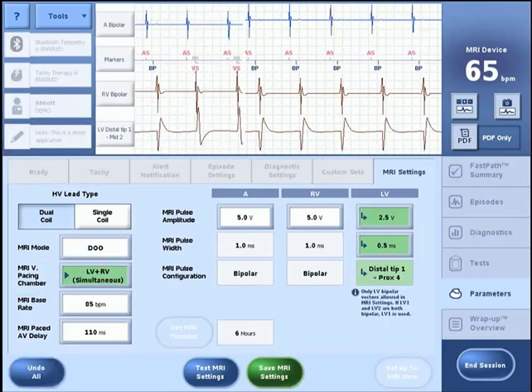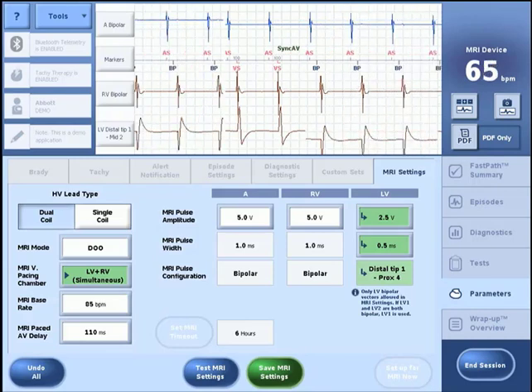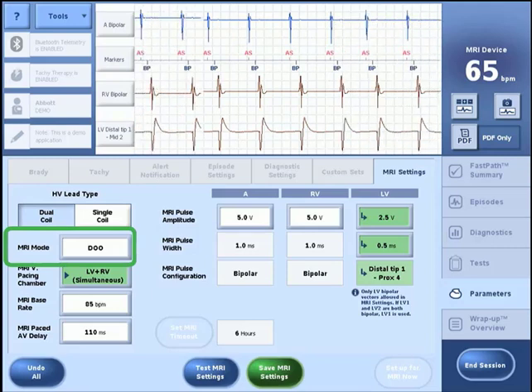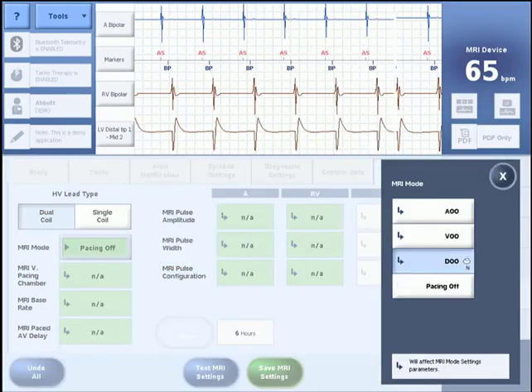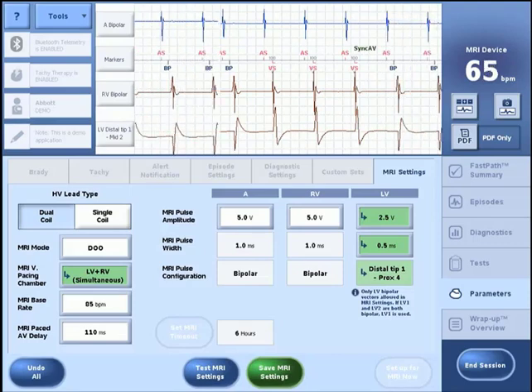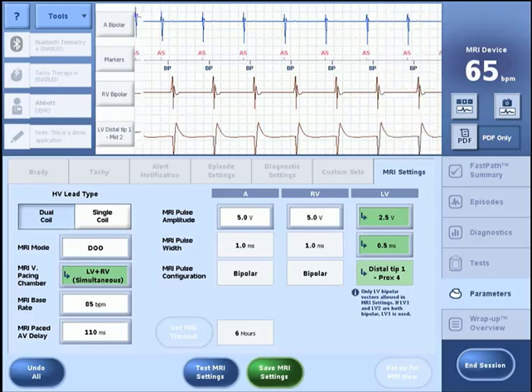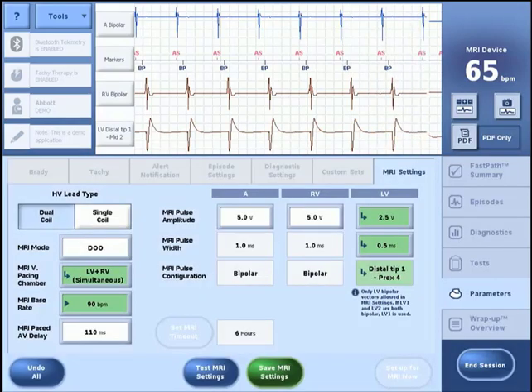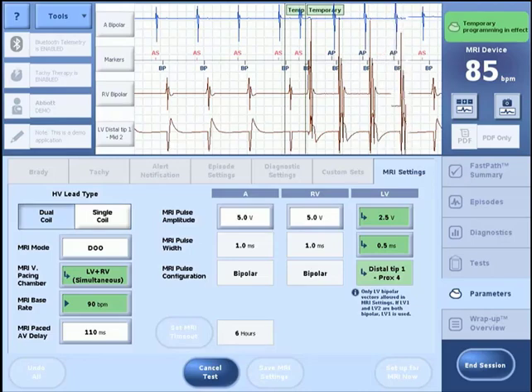When MRI pacing parameters are being selected, determine whether or not pacing support is needed during the MRI scan. When pacing support is needed, set the MRI mode to an asynchronous pacing mode. When pacing support is not needed, set the MRI mode to pacing off. Some patients may be susceptible to cardiac arrhythmias induced by competitive pacing. When an asynchronous MRI mode is selected for these patients, it is important to select an appropriate MRI pacing rate to avoid competitive pacing and then minimize the duration of the asynchronous pacing operation.